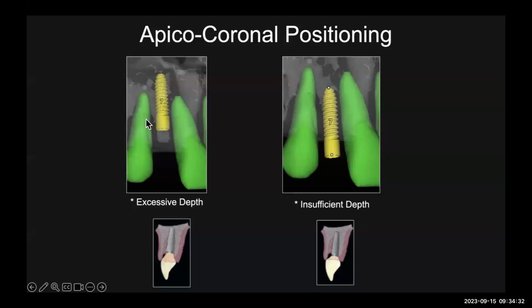And this is where the theory came many, many years ago about running room. Many of you have probably heard about this, where there was a school of thought that you bury the implant not 3 millimeters below the free gingival margin, but 5 or 7 millimeters, and that allows you to build this critical, subcritical contour, or emergence profile.